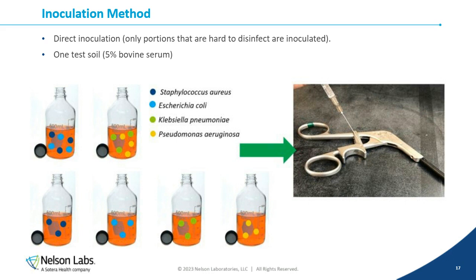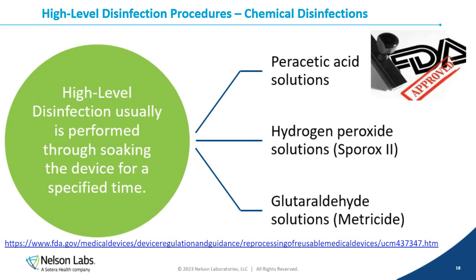So once the devices are inoculated, you'll then, as a part of the validation, move into the disinfection portion, where you will take your device through the disinfection procedure using whatever procedure you have in your instructions for use, which will be based on your disinfection level.